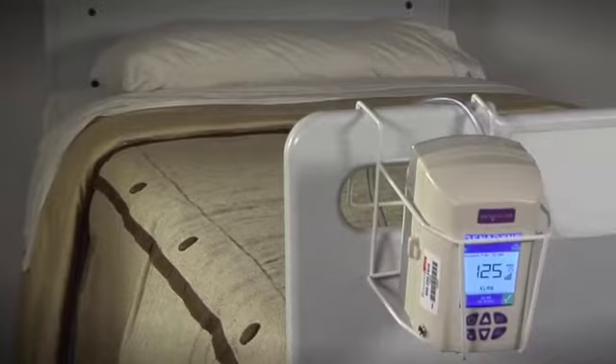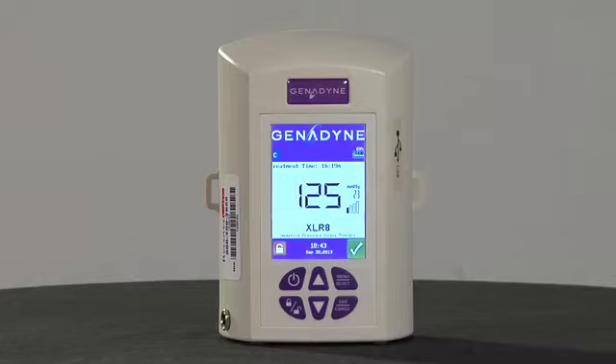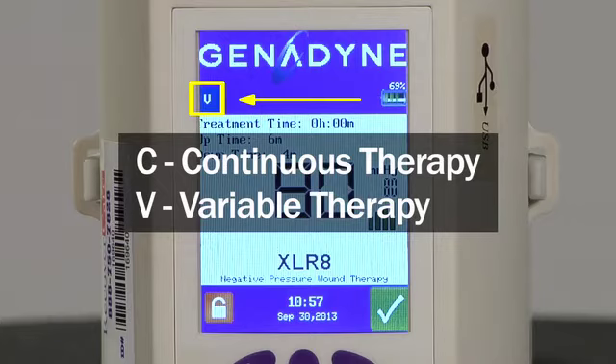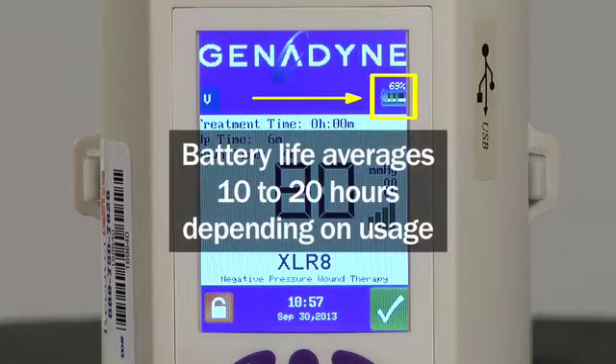The Accelerate Pump weighs less than 1.5 pounds and offers the flexibility of both bedside and ambulatory therapy. All information pertaining to pump operation is located on the front panel. The Therapy Mode icon is displayed in the upper left corner. Either a symbol C for continuous therapy or V for variable therapy is always displayed to indicate the type of therapy being delivered. The battery icon bars provide information on battery life, averaging 10 to 20 hours depending on usage.